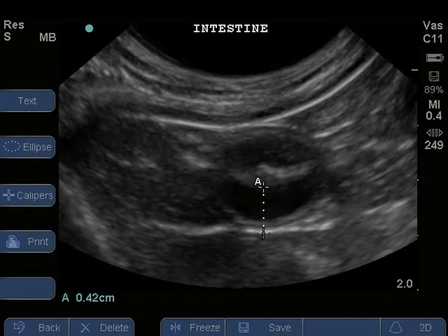In the normal empty intestinal loop, 5 distinct layers can be seen. This is an example of a short-axis view. In the center of an intestinal loop is a hyperechoic lumen containing mucus. The next layer is a relatively thick hypoechoic mucous membrane layer which produces the mucus.